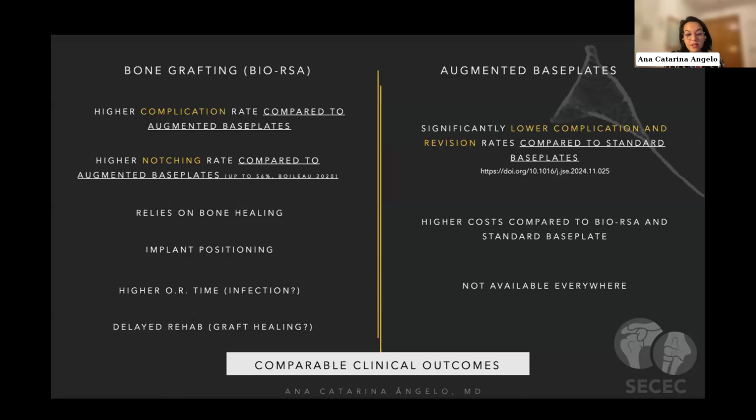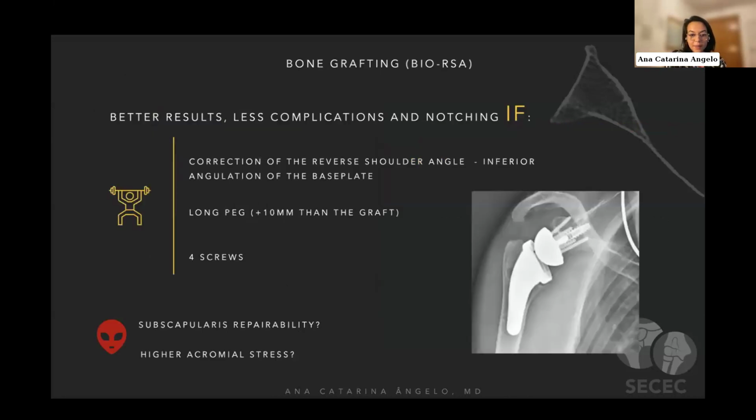It's very, very dependent on the positioning of the implant due to the transmission of the forces. It may have a higher OR time, and it may increase the rate of infection. This is not proven. Of course, it's just theoretical. And usually you delay the rehabilitation a little bit because you're waiting for the graft to heal to avoid failure. Nevertheless, clinically, they have comparable outcomes, okay?